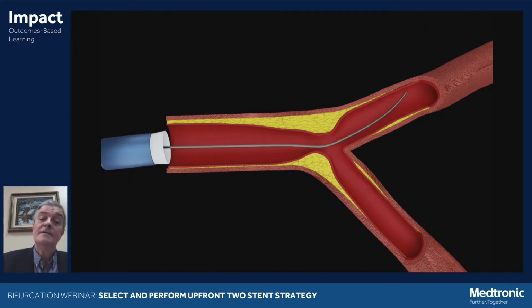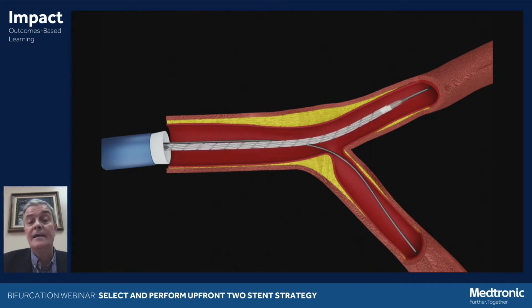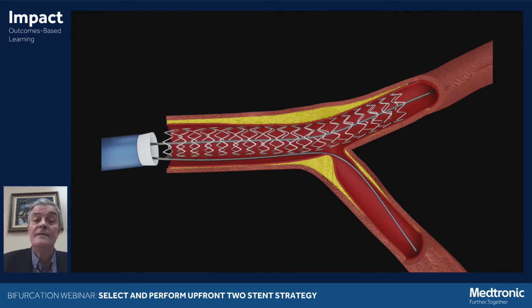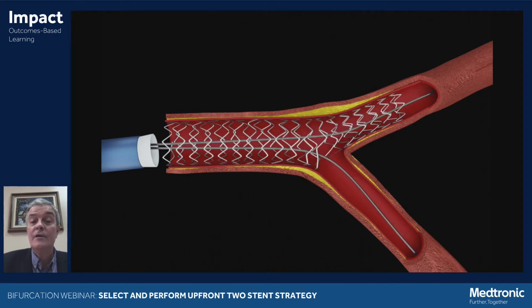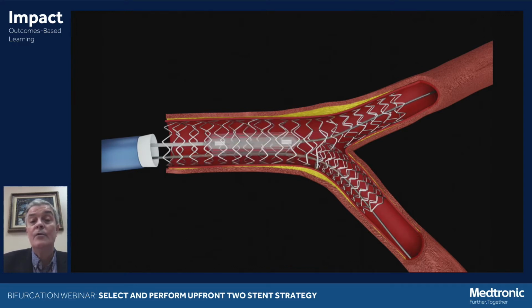The second technique, which is also standard today, is TAP stenting. It's more for bifurcations with a close to 90-degree ostium, for the left main. After predilatation, we stent across. Then we do proximal optimization. And after proximal optimization, a pullback maneuver to rewire. We do kissing balloon inflation. And after kissing balloon inflation, we position the stent into the circumflex with a balloon which is non-inflated in the LAD. And then we do kissing balloon inflation and final proximal apposition.